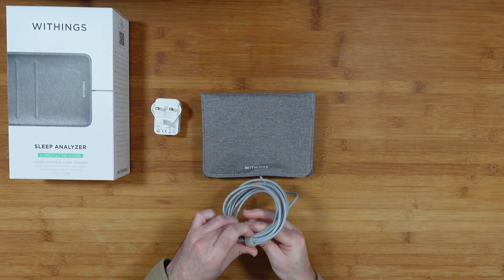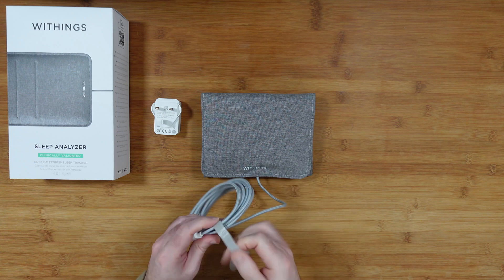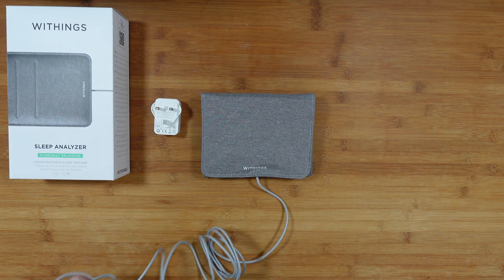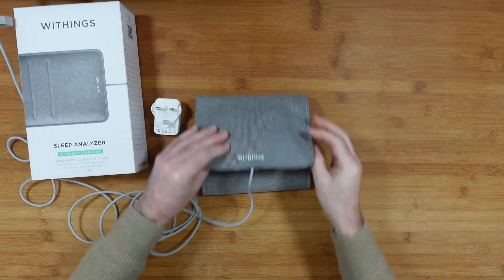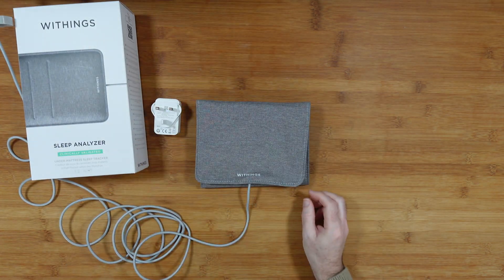I can actually plug this in just to see what happens. I'll plug it into a power adapter I've got on my desk here to see if it wakes up and I can connect it to the app.